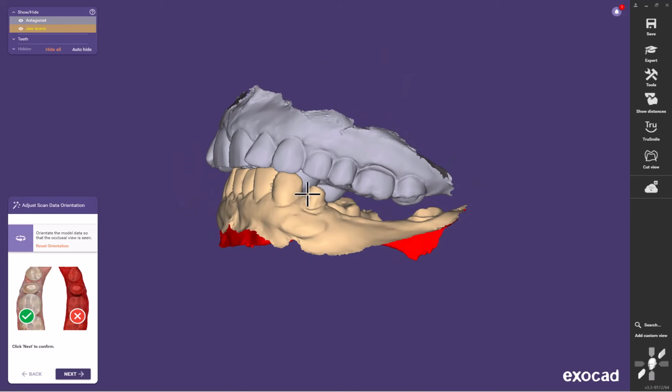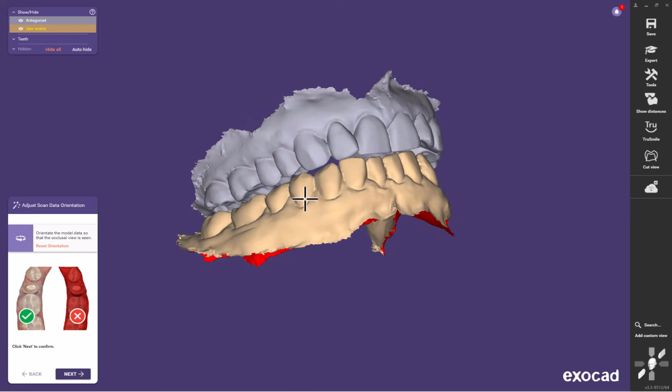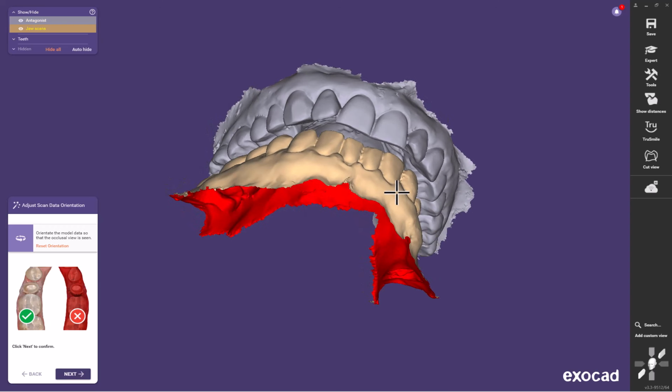Now, obviously, we want to put a crown here on this tooth and a couple of implants back here. So I'm beginning to think, what do we need to do with the occlusion to try to stabilize her? And can I equilibrate her so that centric relation and centric occlusion are the same? So this bite is taken in centric relation with the jaws fully seated, the condyles fully seated up in the fossa, and when we hinge her in, of course she hits prematurely and then slides in until the front teeth touch, or at least come closer.